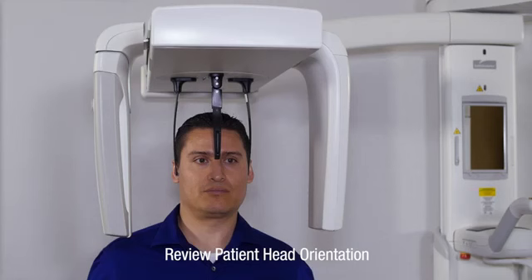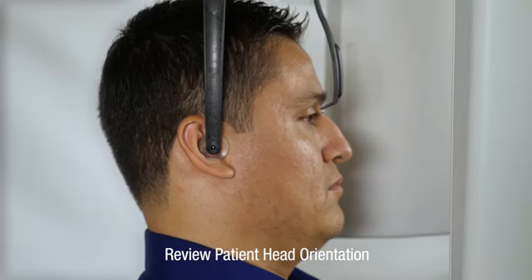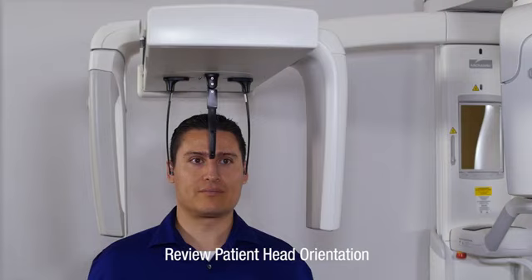The patient's head position should be reviewed to make sure it is correct along three axes. From a side lateral view, the Frankfurt plane, bottom of orbit to otic posts, should be level horizontally. From a frontal view, the patient's face should be straight forward without any twisting. Also from the front, ensure the patient's head is not tilted but vertically straight.